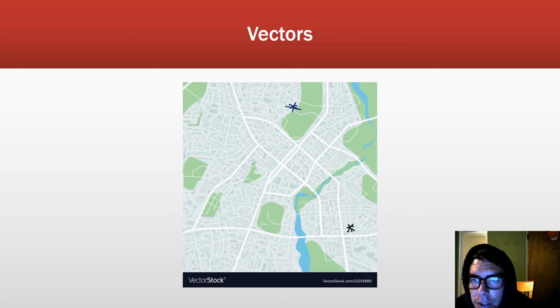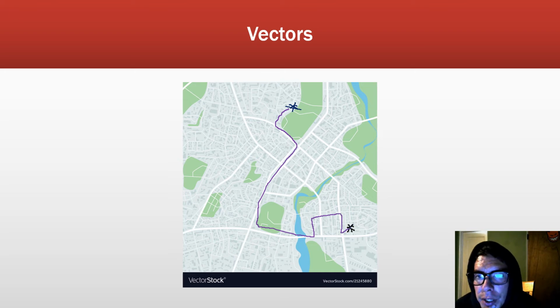So to get to work, they might have to come down this way, over there, up to there. They might actually even come down this way, go this way. Say there's some weird detour, they have to go that way, and then they get to work. So see, they went all these different directions, but overall, this would be the direction of their vector.